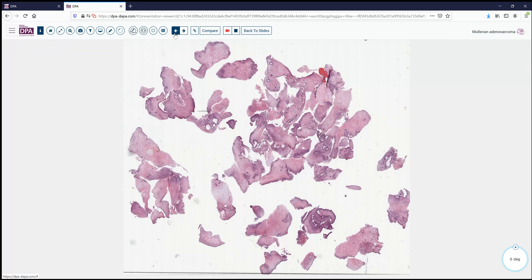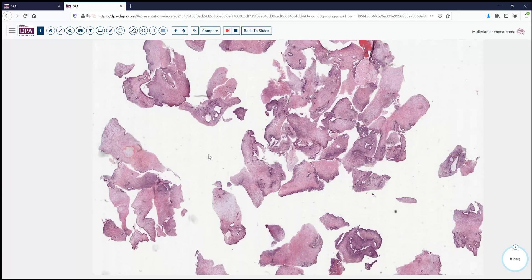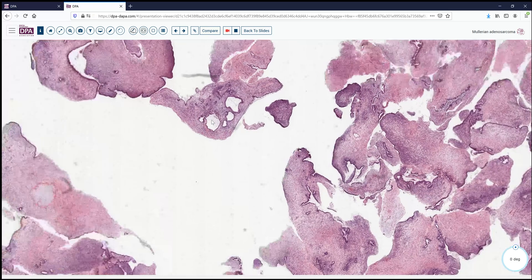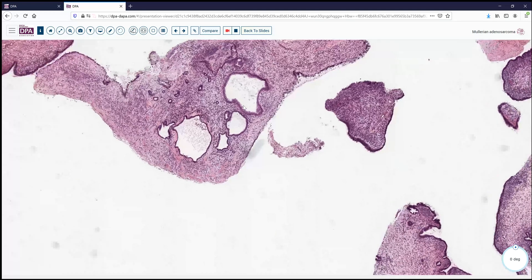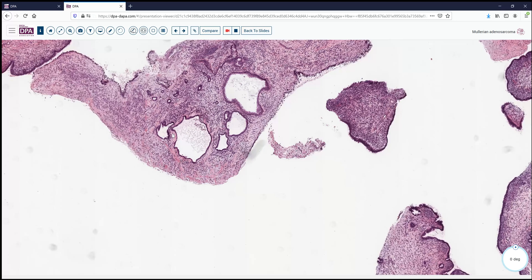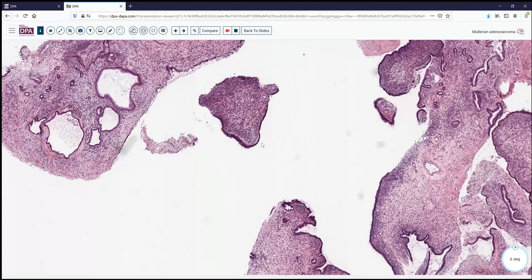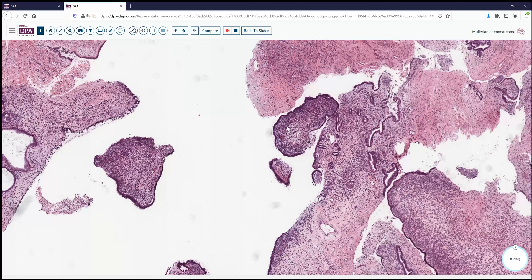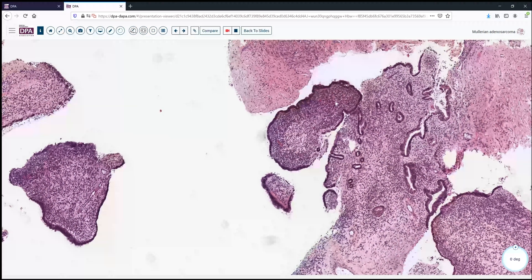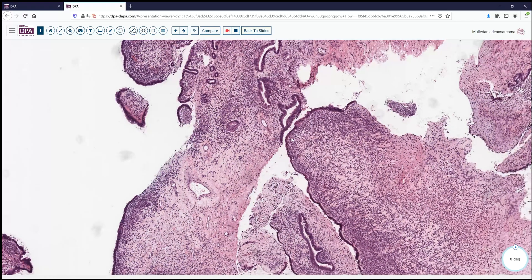We can see immediately at low power this is not normal endometrium. There's a very pink appearance to the lesion, a mixture of glandular elements and some pink and bluish stromal elements. As we look at some of these glandular elements, they don't seem to have too much in the way of atypia in terms of either architecture or even to any great degree in terms of cytology. We can see fairly low columnar epithelium, and the glands and tissues are formed in somewhat leaf-like patterns.